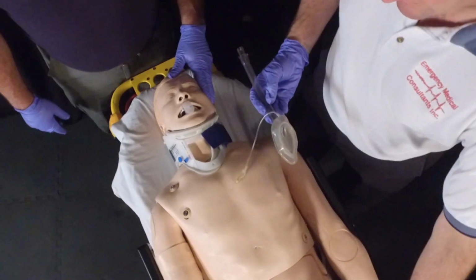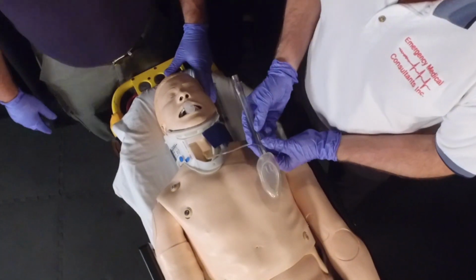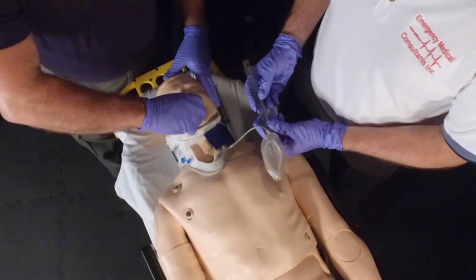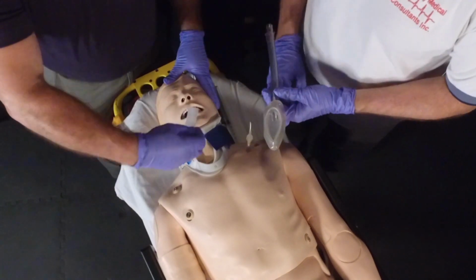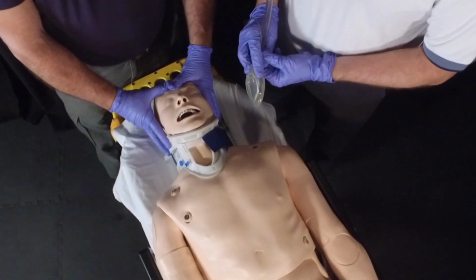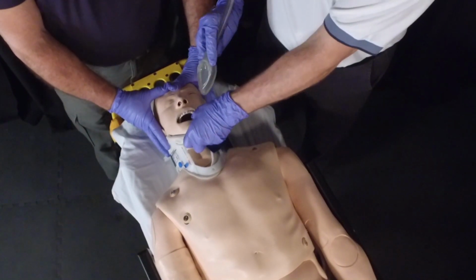The laryngeal mask airway is basically sized based on the patient's weight, and once the patient has been oxygenated and ventilated appropriately, it can be just put in the neutral position and slid down to the posterior pharynx and inflated very quickly.